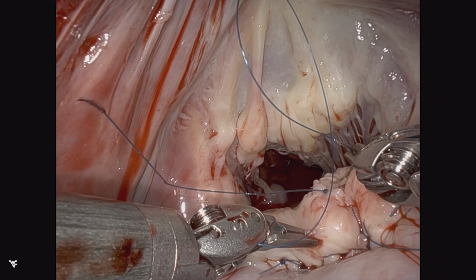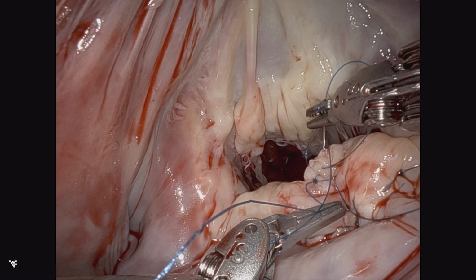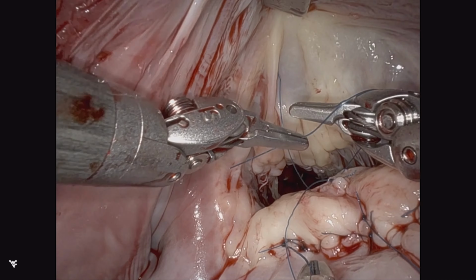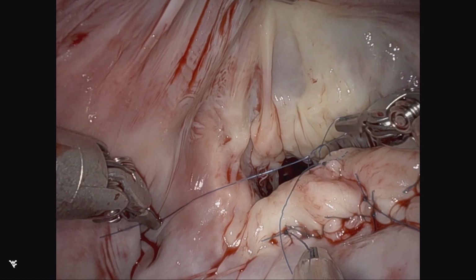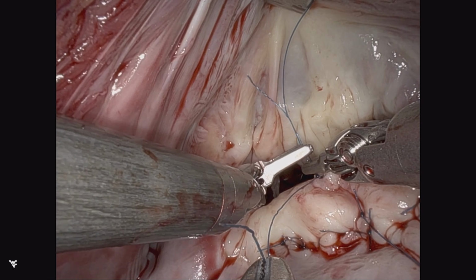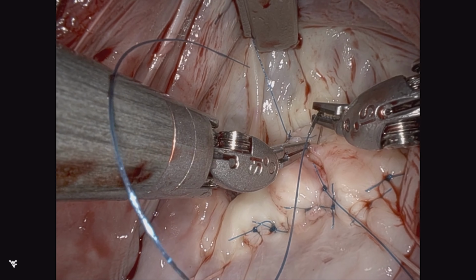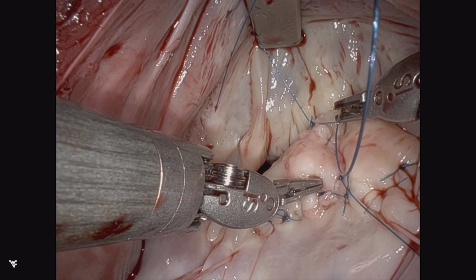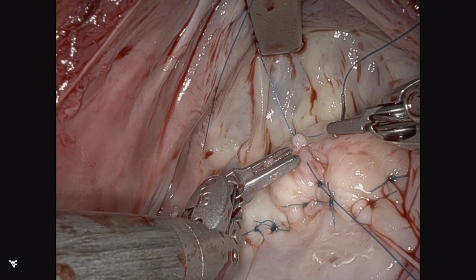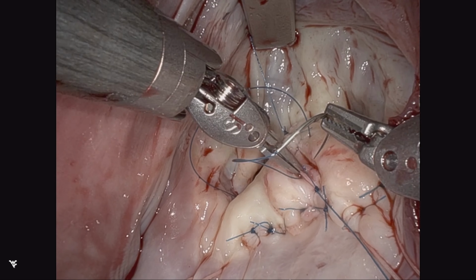This is substantiated by another edge suture, which is usually a simple stitch. And then again, using the fingers approach of the dual blade retractor, this presents the valvular tissue to allow the remainder of the valvuloplasty to be done fairly easily.